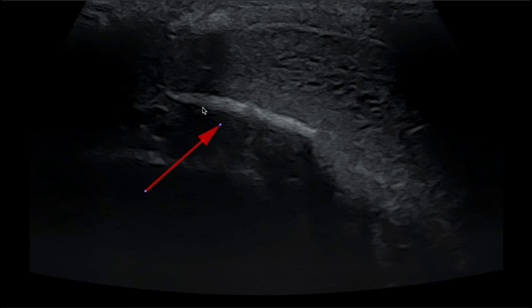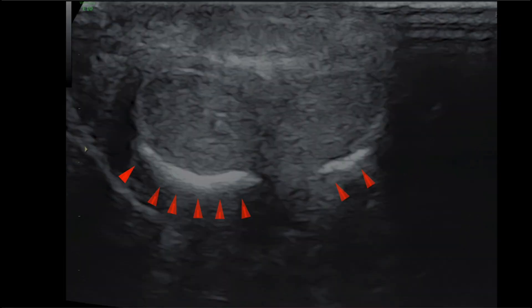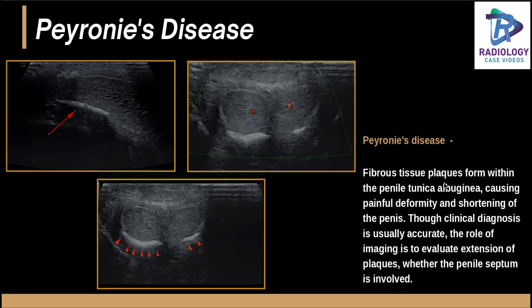Coming to another USG case: a large hyperechoic area representing a calcium plaque is seen. This is a penile Doppler study showing penile plaques of different sizes outlining the corpora. This is a classical case of Peyronie's disease — fibrous tissue plaques within the penile tunica albuginea causing painful deformity and shortening of the penis. Though clinical diagnosis is usually accurate, imaging can evaluate the extension of plaques and whether the penile septum is involved, which is important for treatment planning.